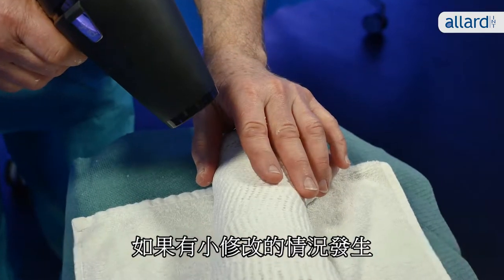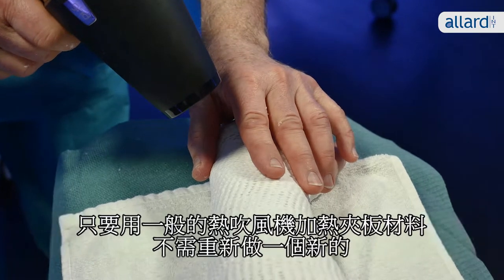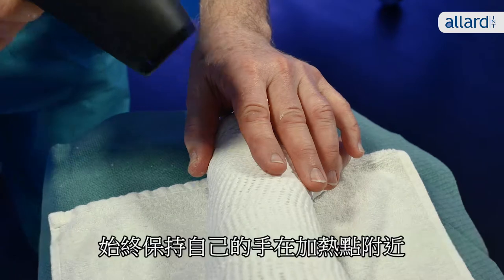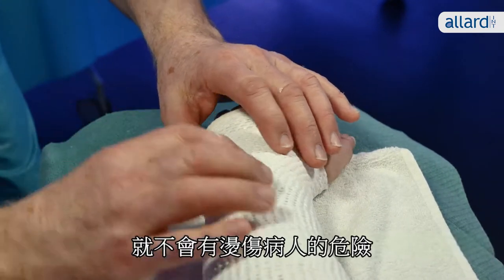If a situation occurs which requires small changes to your splint, you can use a regular hair dryer to reheat the material instead of making a new splint. Always keep your own hand near the point you are heating so you don't risk burning the patient.